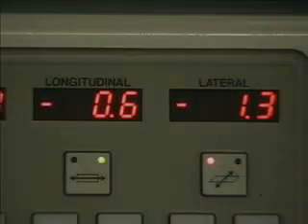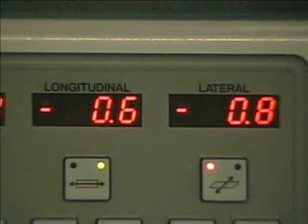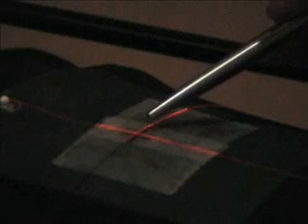Looking at the table coordinates, I have a value of 1.3. If I move the table laterally 0.5 centimeters, I get a value of 0.8. Now, we come back, we look, and the shift was in fact moved, and it is also to the patient's left. I have verified that I have done the shift correctly. The shift is now complete.